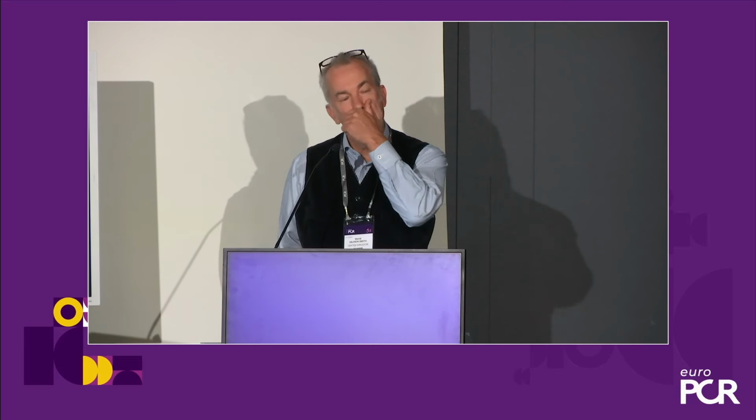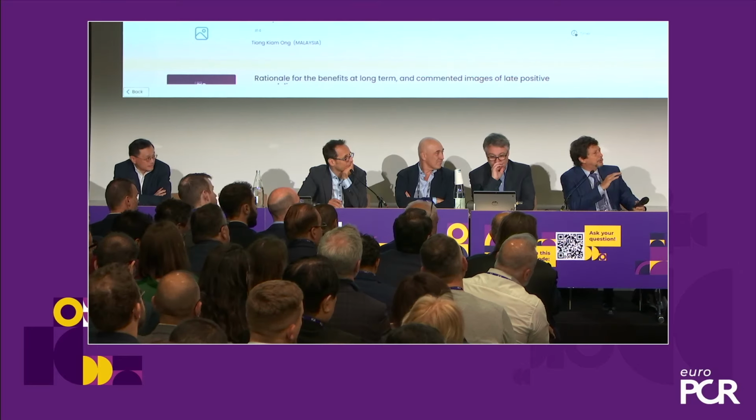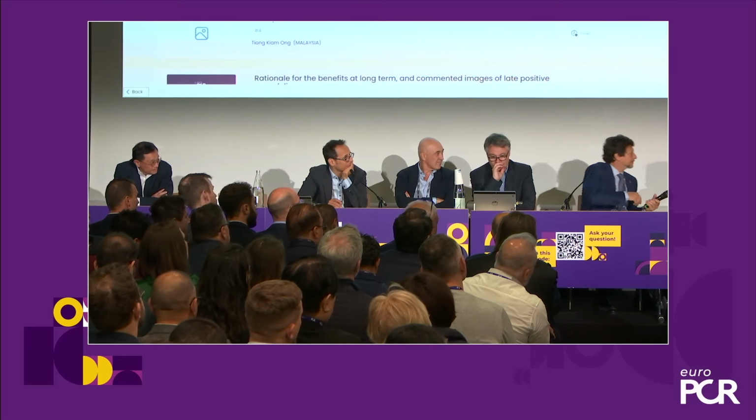So put it this way, every angioplasty I do now, I will do thinking, can I do this with drug-coated balloons? And only if I can't, will I then consider, okay, fine, we need a stent. So it's really a bailout phenomenon for me now already. So it means that there is no contraindication, there is no lesion in which you would not consider it.